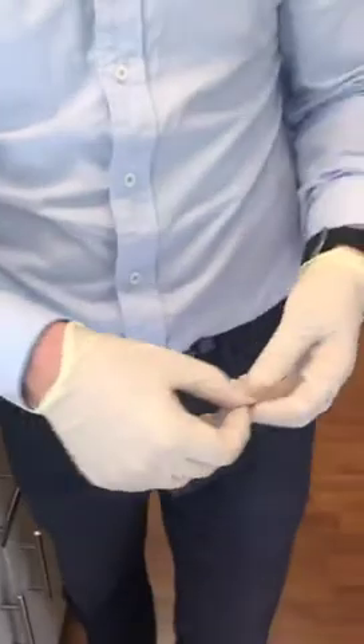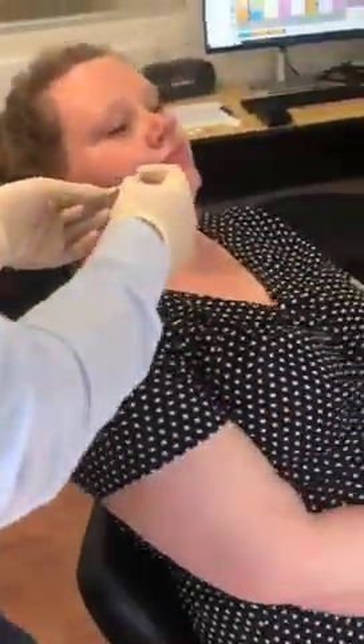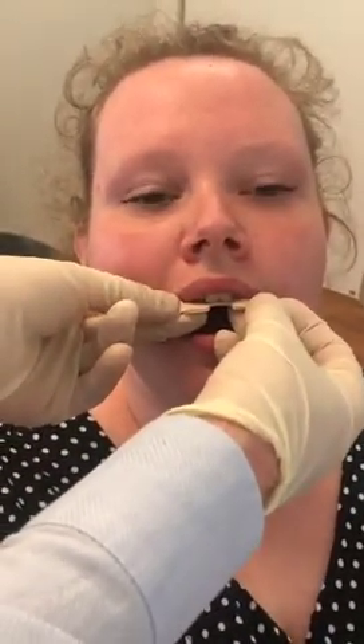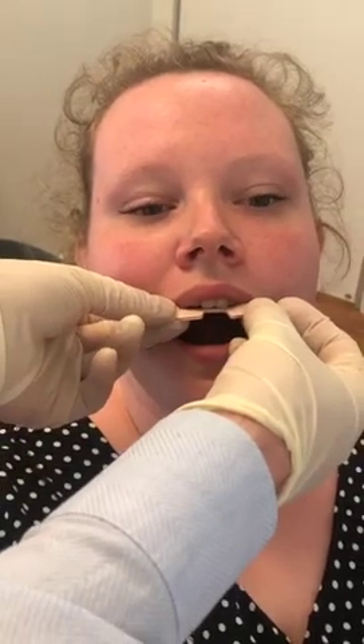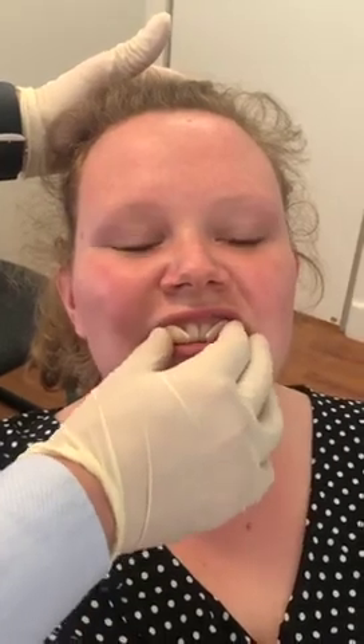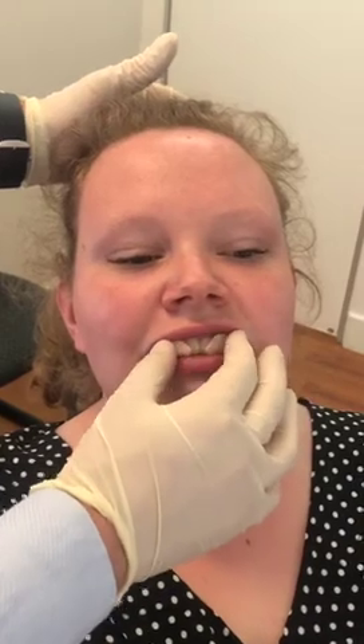Now we are going towards the patient. We align the top to the top teeth so the incisal edge is just at the slot. We then get the patient to bite down into their natural position. We pop our hand behind the patient to support them and mould the little side parts towards the teeth, asking the patient to gently hold that position but not clench.